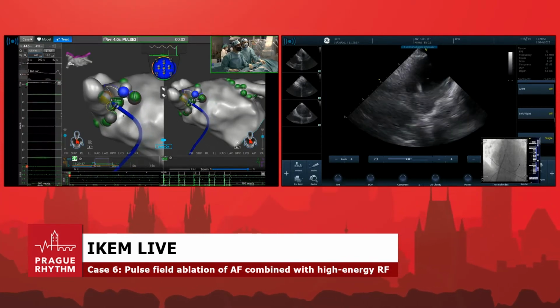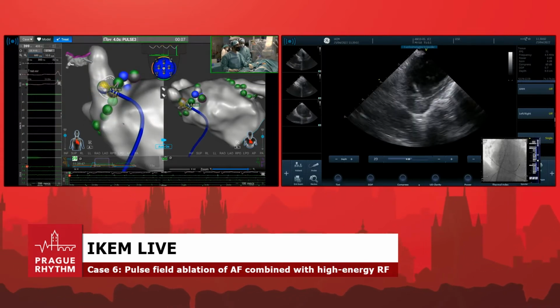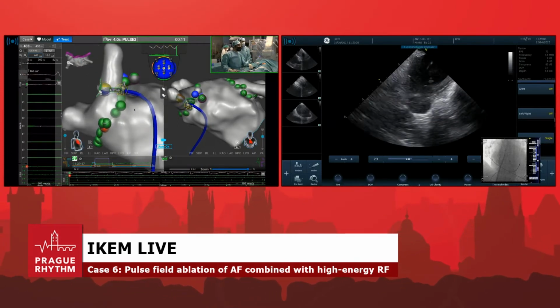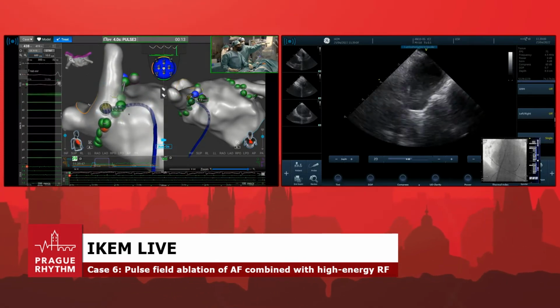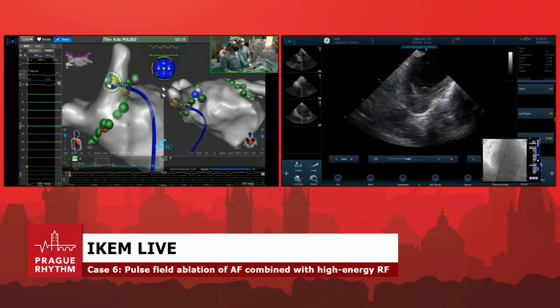Okay, so the vein is isolated. Let's just see the vein, please, the electrograms in the vein. There are no electrograms in the veins. They are dissociated. You have dissociated potentials in the distal electrode, the top one.